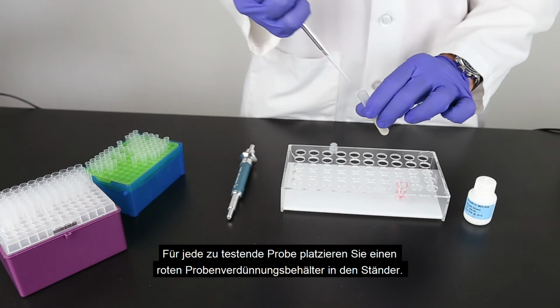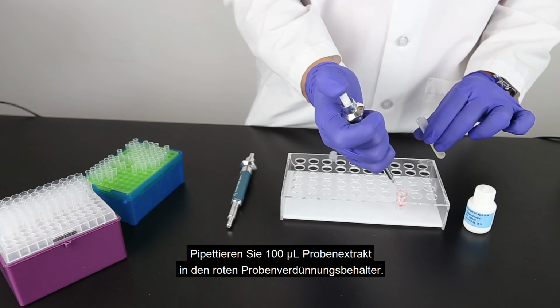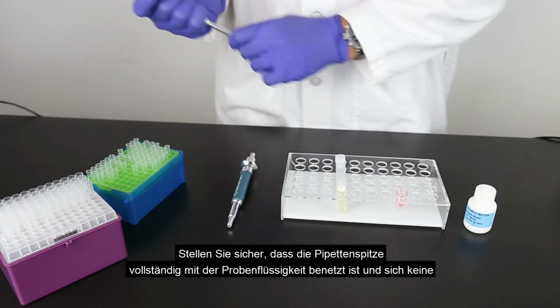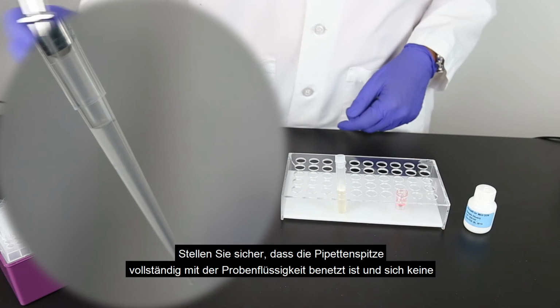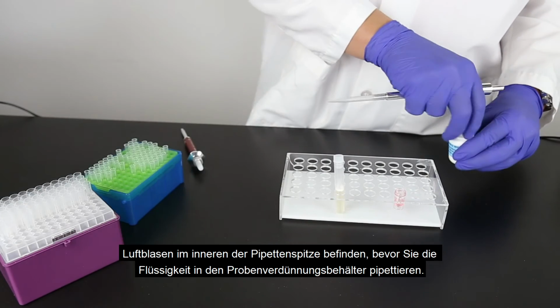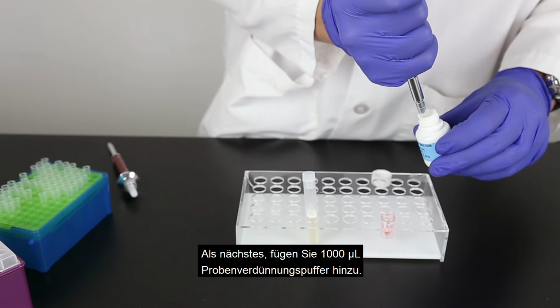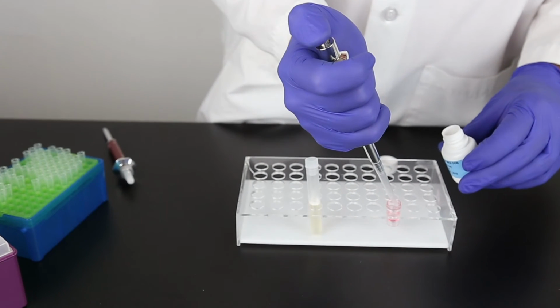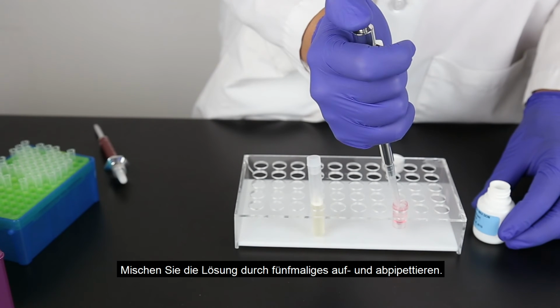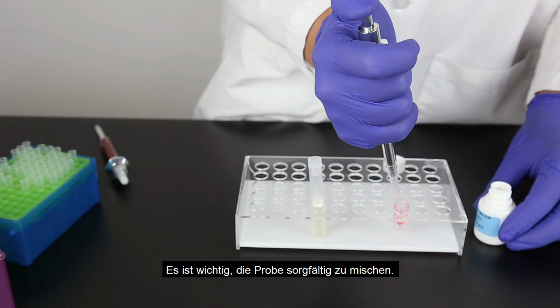For each sample you are testing, place a red dilution cup into the sample rack. Add 100 microliters sample extract to the red dilution cup. It is important to make sure the pipette tip is fully charged with liquid and doesn't have any air bubbles prior to dispensing the liquid into the cup. Next, add 1,000 microliters sample diluent to the sample cup. Mix by pipetting up and down 5 times. It is important to mix thoroughly.